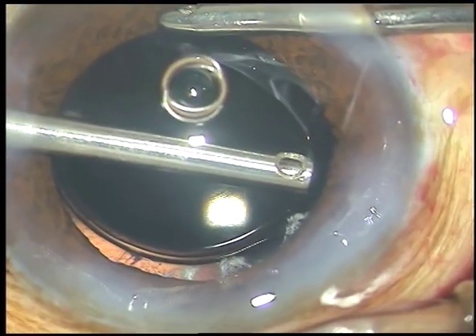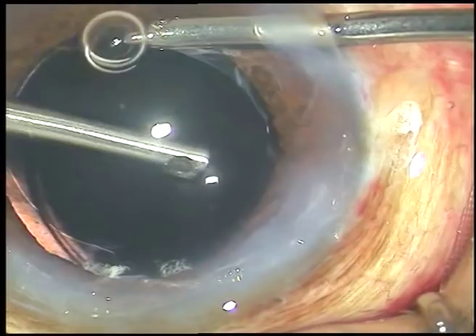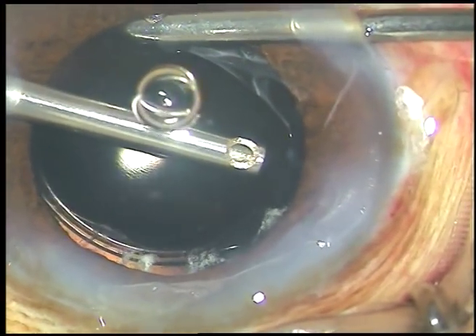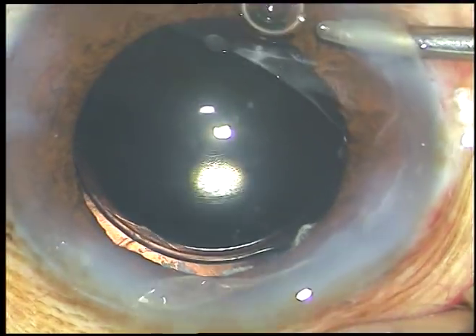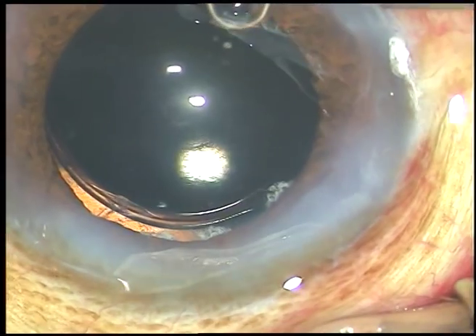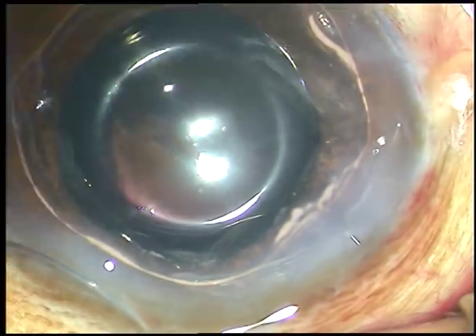Before I remove the irrigation, I am doing some more cutting. The pupil appears good — the pupil is now round. The pupil should be round and trimming of vitreous should be very thorough to get a nice postoperative appearance. Before I come out, I inject an air bubble to tamponade the vitreous so that no more vitreous comes out through the dehiscent area.